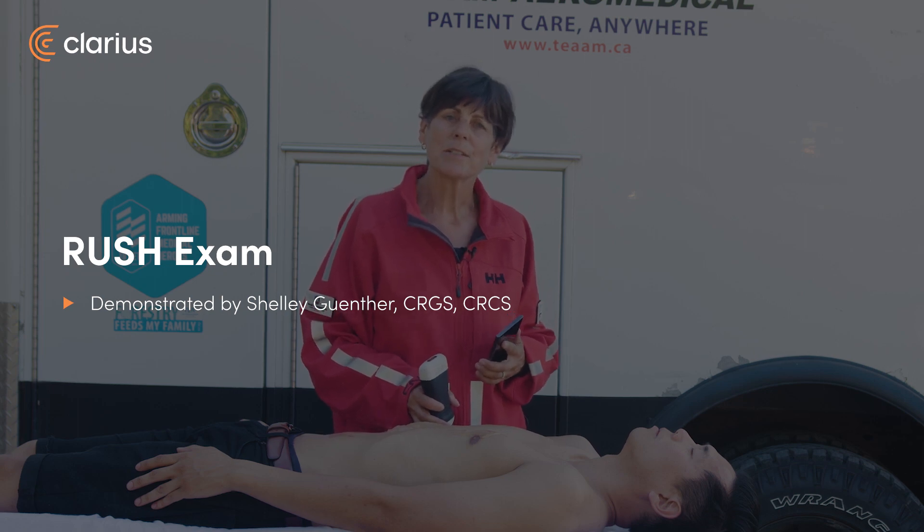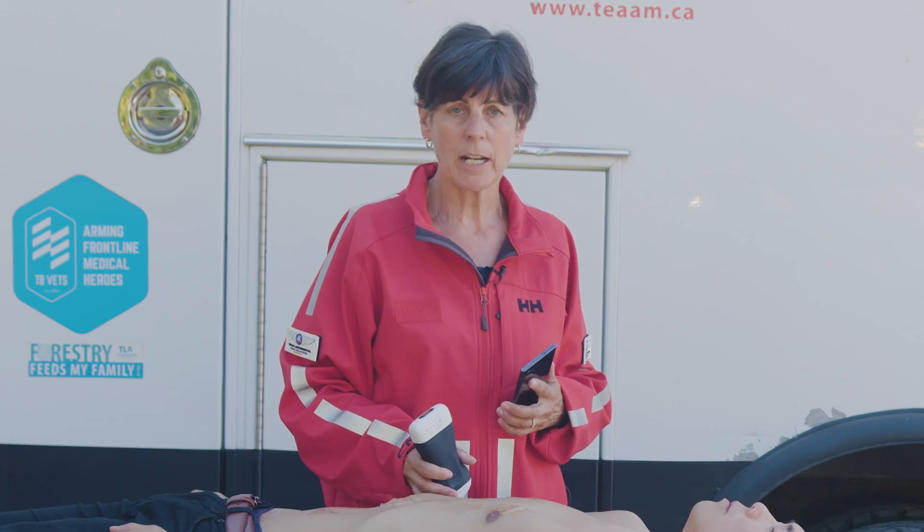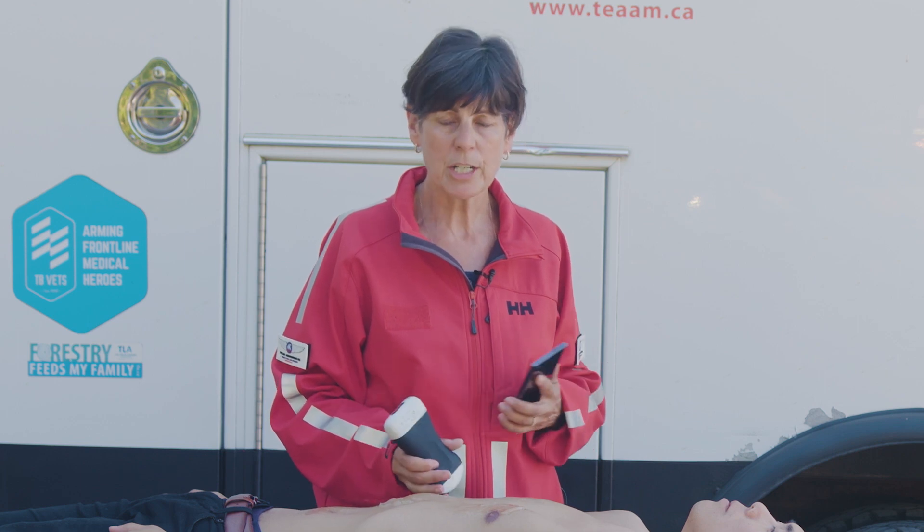Hi, my name is Shelley and today I'm going to explain a RUSH exam. RUSH stands for Rapid Ultrasound for Shock and Hypotension, and it's used in patients that are presenting with undifferentiated hypotension.